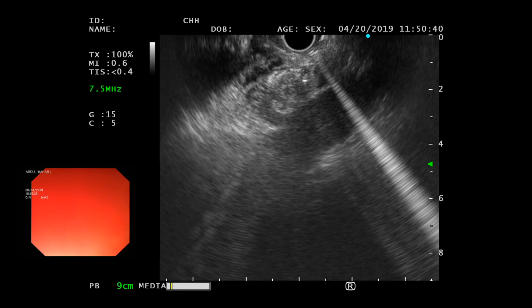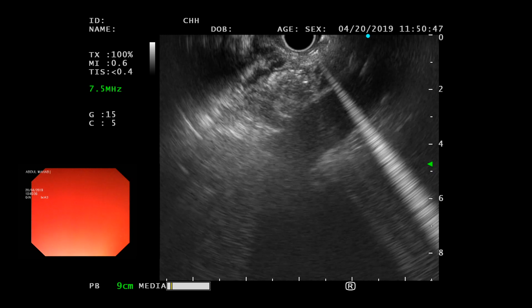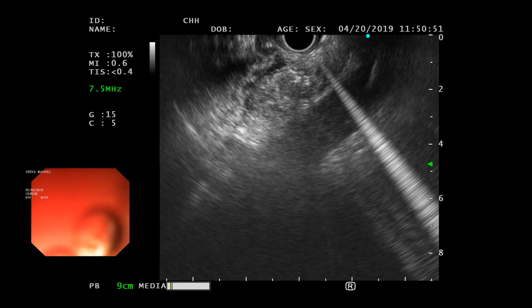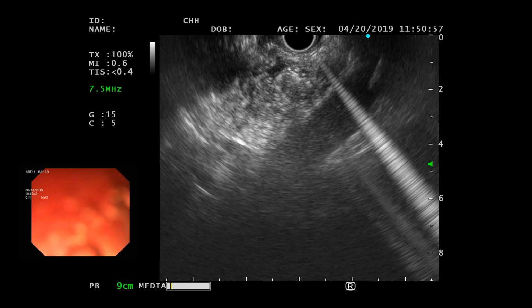So you see now, once you've injected, Khalid, personally, there's nothing you can see really, so you just keep. Yeah. My mentor actually taught me this. Let me pass it to your mentor.